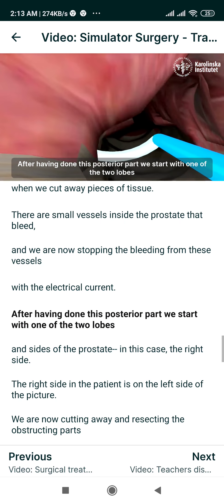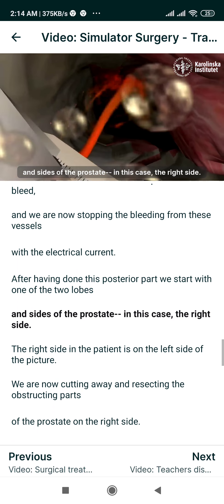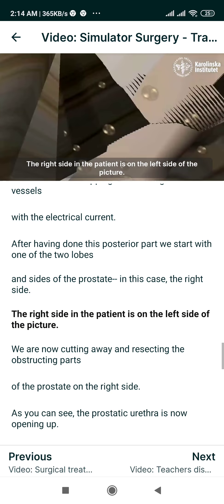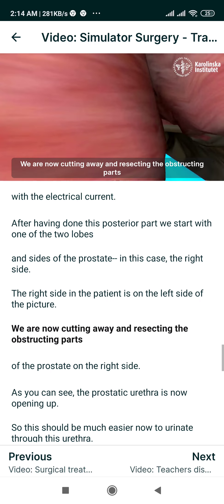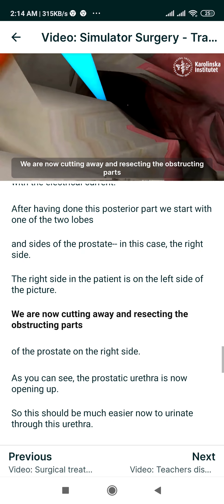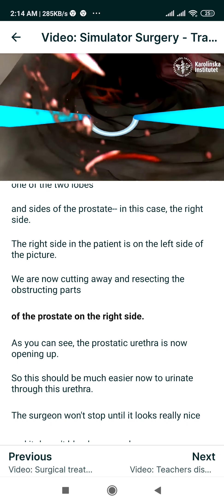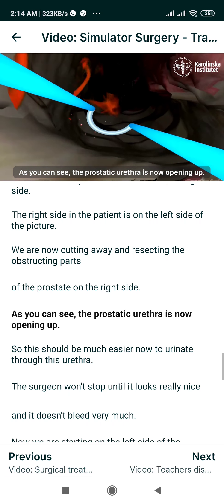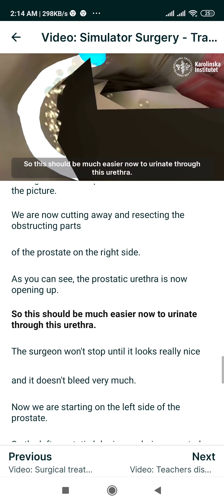After having done the posterior part, we start with one of the two lobes and sides of the prostate — in this case the right side. The right side in the patient is on the left side of the picture. We are now cutting away and resecting the obstructing parts of the prostate on the right side. As you can see, the prostatic urethra is now opening up, so this should be much easier now to urinate through this urethra.